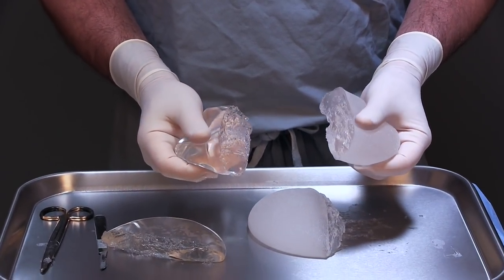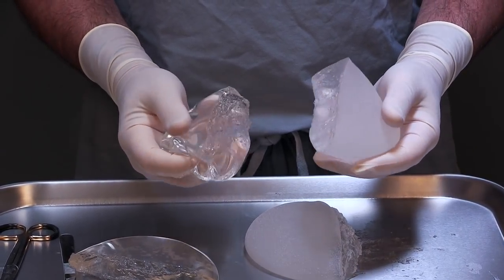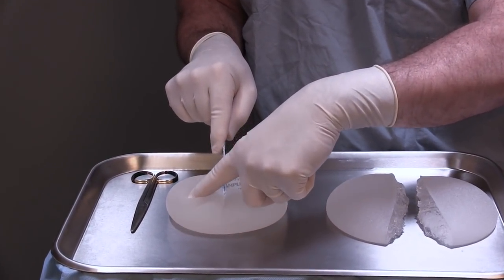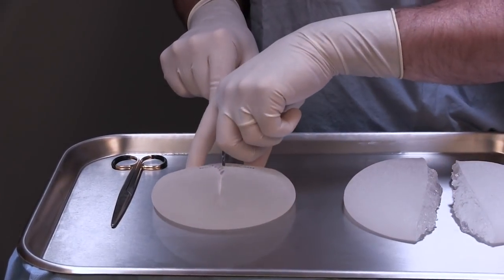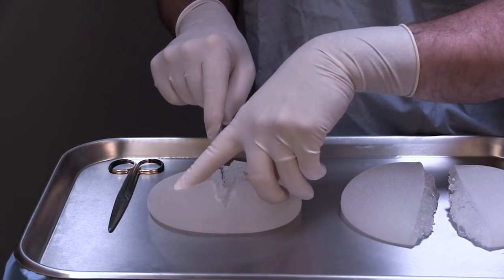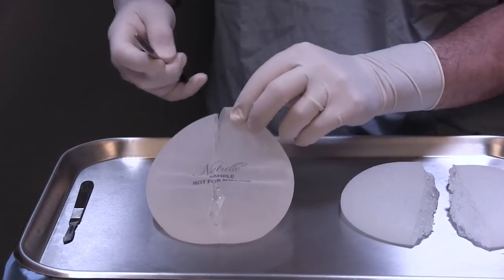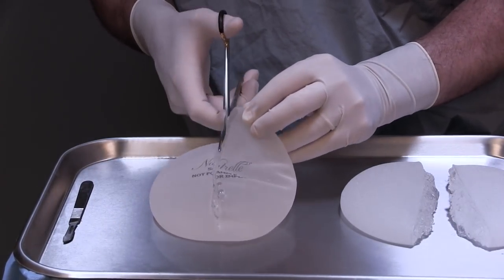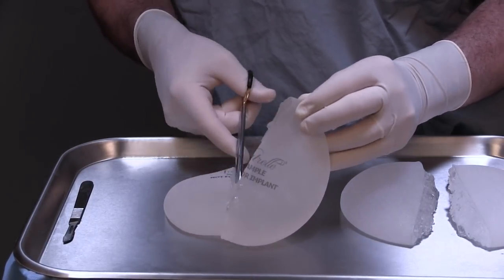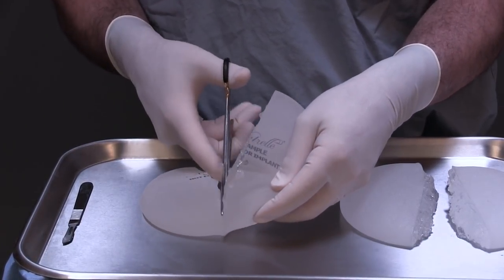I decided to cut one more implant in half. This implant is created by a company that claims it is truly form-stable. Their point is that although it is soft, it really does hold its form, and if you squeeze it and let go — and God forbid it was ever ruptured inside a patient — the silicone gel inside will not go or ooze anywhere, and will not be resorbed by the body. As I cut it in half, it is certainly less sticky than the first two and it cuts a little nicer, seeming to hold its form a little better.